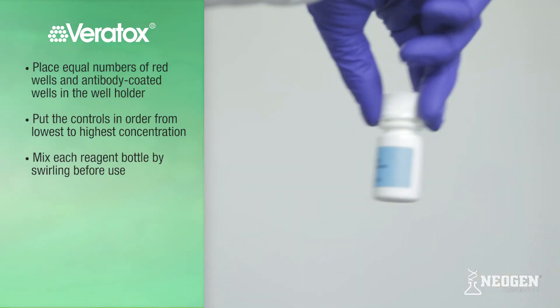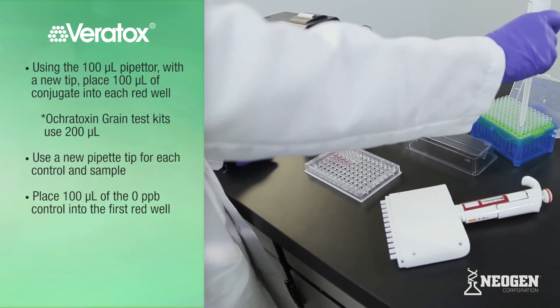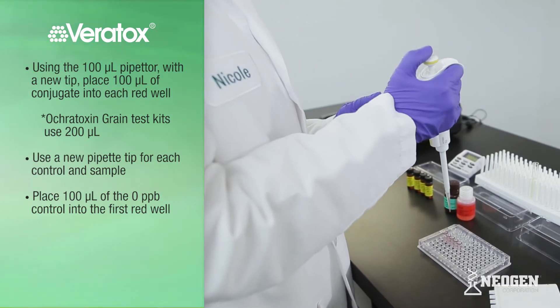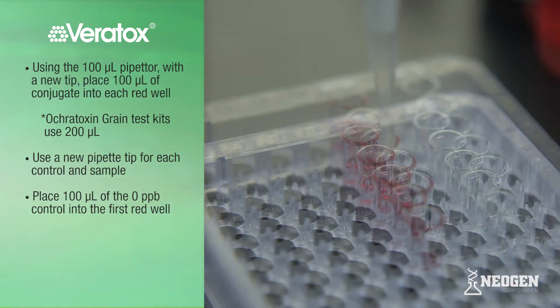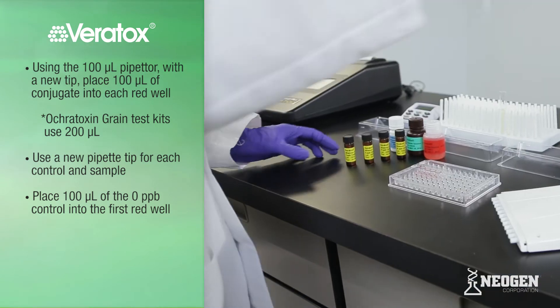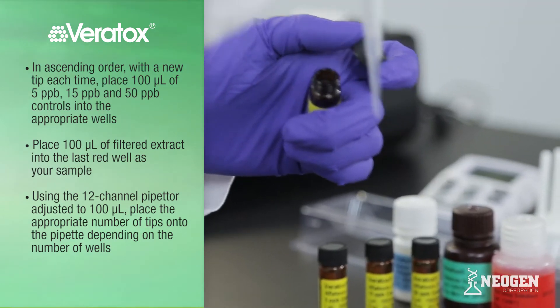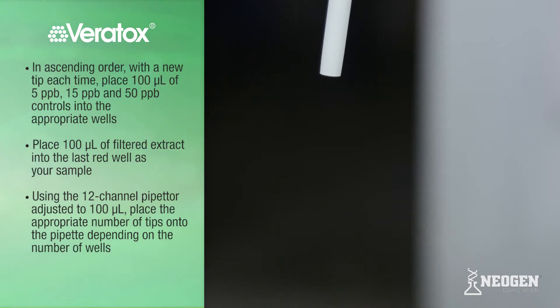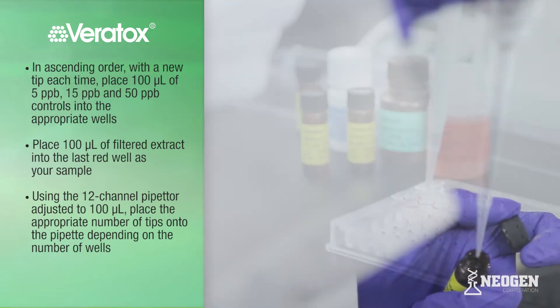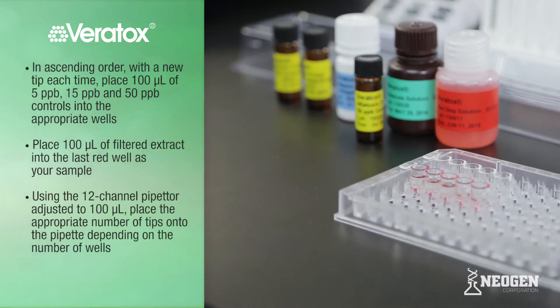Put the controls in order from the lowest to highest concentration. Reagent bottles should be mixed prior to use by swirling each bottle. Using the 100-microliter pipetter and a new tip, prime and pipette 100 microliters of conjugate into each red well. Note that the Ocratoxin grain test kit uses 200 microliters of conjugate for each red well. Using a new pipette tip, prime and pipette 100 microliters of the zero control into the first red well. In ascending order with a new tip each time, place 100 microliters of 5, 15, and 50 ppb controls into the appropriate wells. If using other test kits, make sure to place controls in ascending order based on the value stated on each vial.